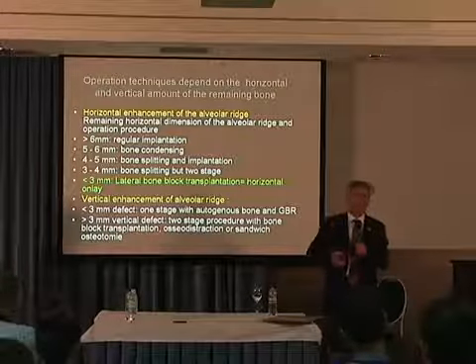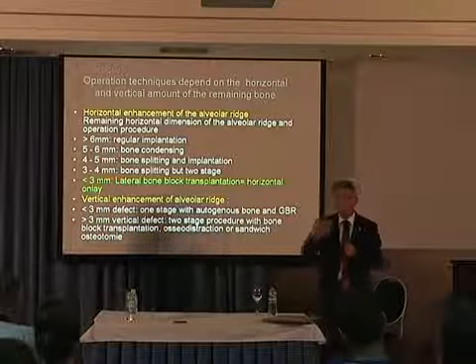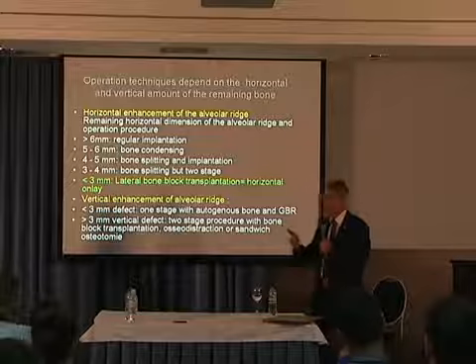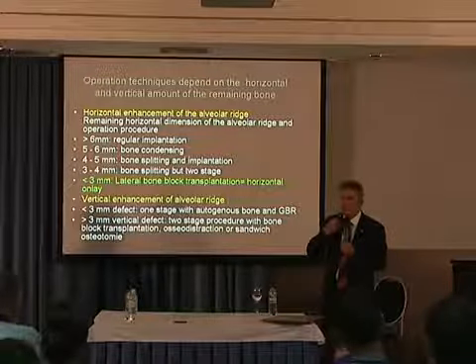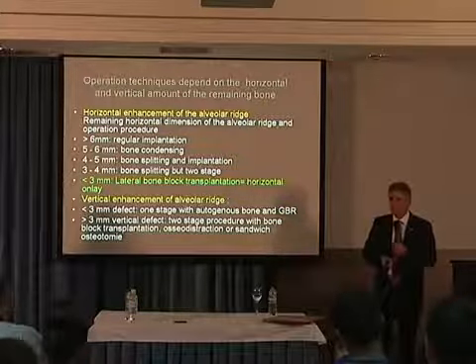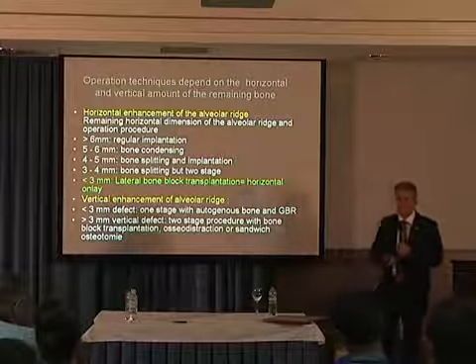One point. On the lower, because in the maxilla it is easier with the soft tissue management, the nutrition, the blood supply, and so on. In the mandible, where is it more critical? In the front, premolar or molar? Окей, он согласен с вашим мнением, что на верхней челюсти легче произвести аугментацию блоком, потому что там и легче управлять, и легче справиться с мягкими тканями. Хорошее кровоснабжение и регенерация, конечно, будет лучше.